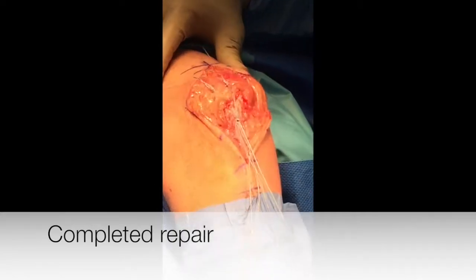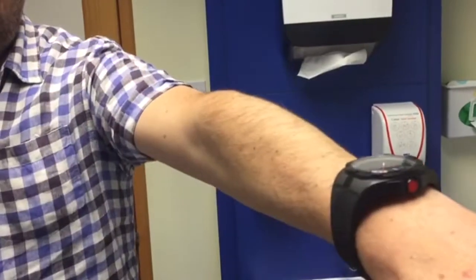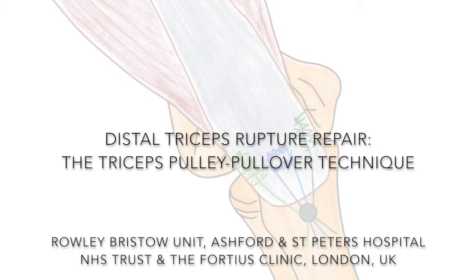The repair is now complete. The wound may be closed and rehabilitation may now begin.